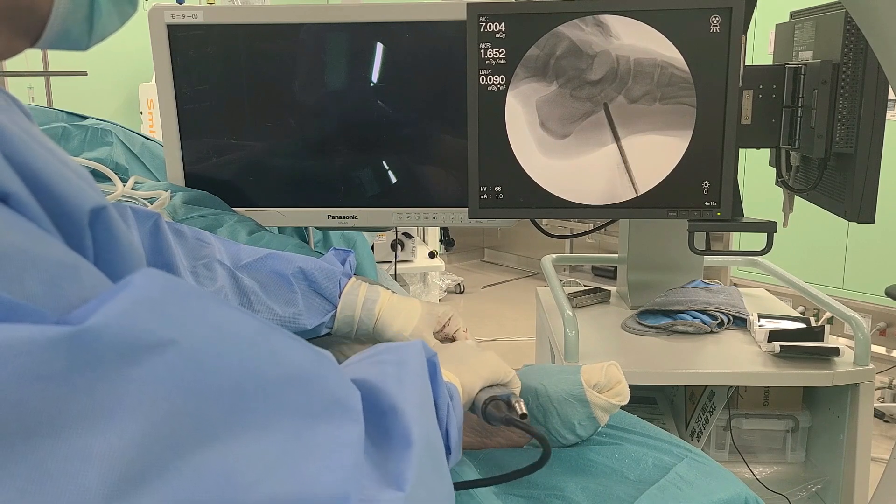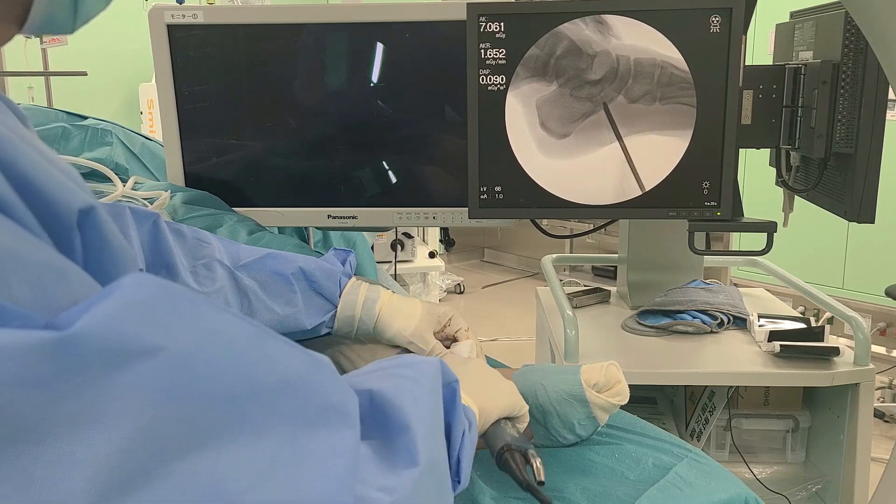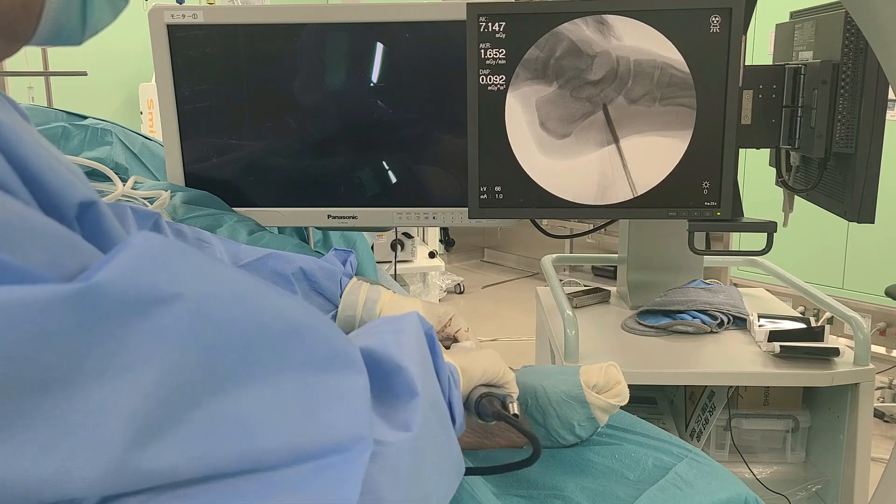A 3 mm hooded abrasion burr is introduced through the portal and the accessory navicular is resected under fluoroscopic guidance.